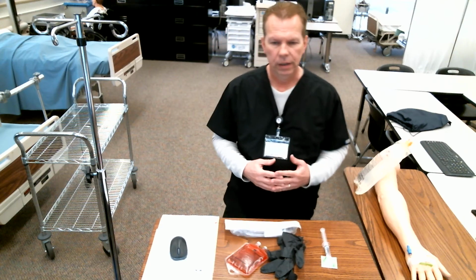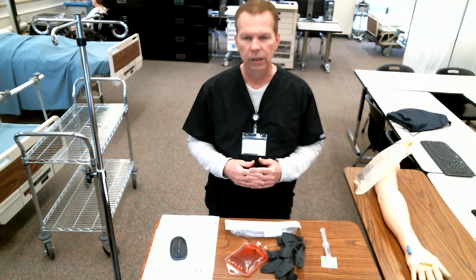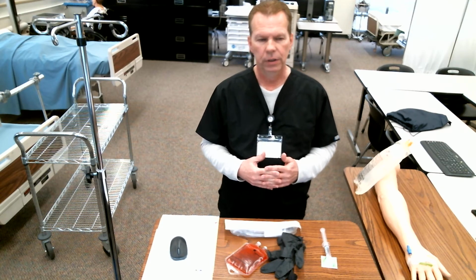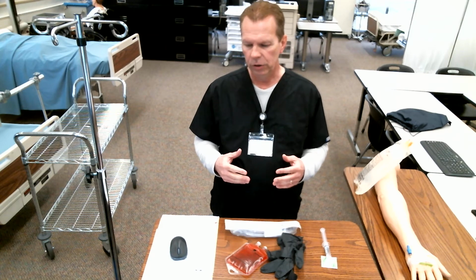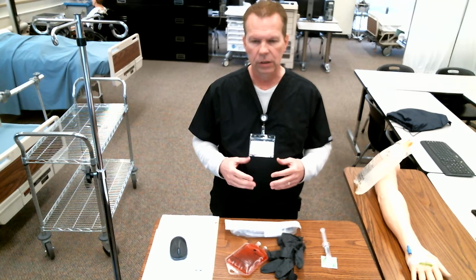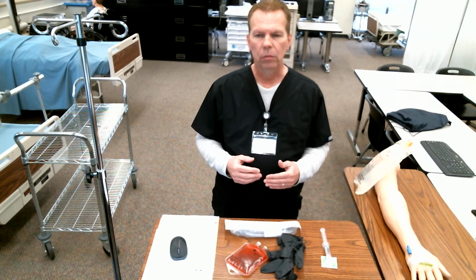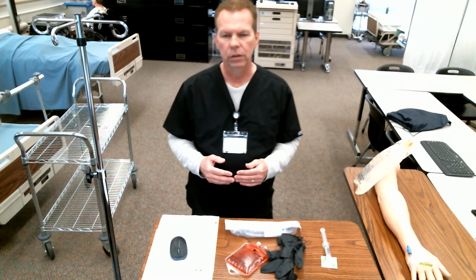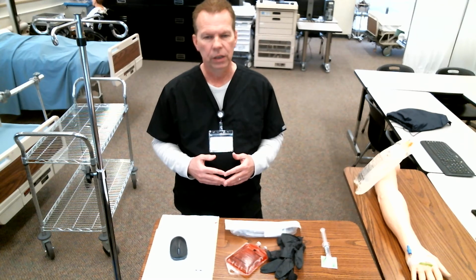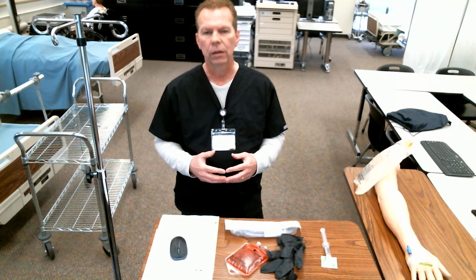All right. Hello to my LPN students, and our skill for today that I'm going to demonstrate for you is blood administration. Blood administration is a skill that we need to be very careful with. There are multiple checks that we have to do in order to administer blood or blood products. And so we've got to be diligent in these safety checks that we do.